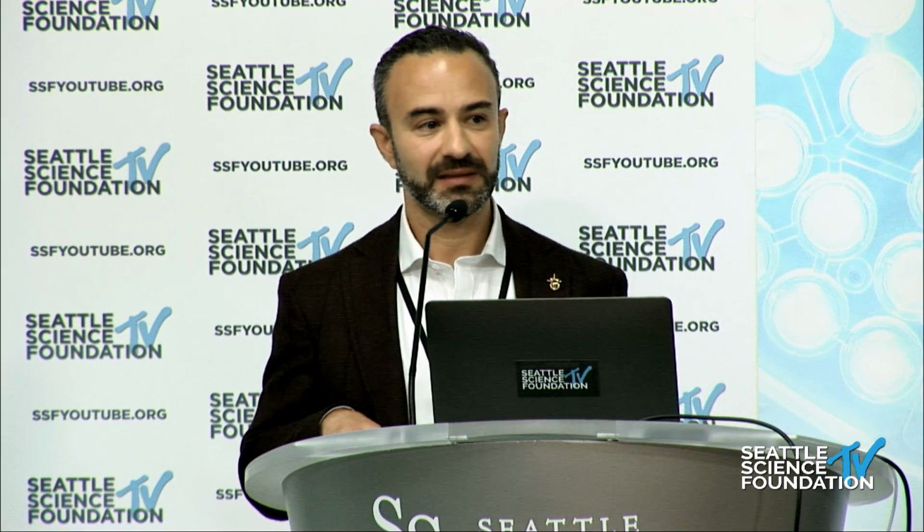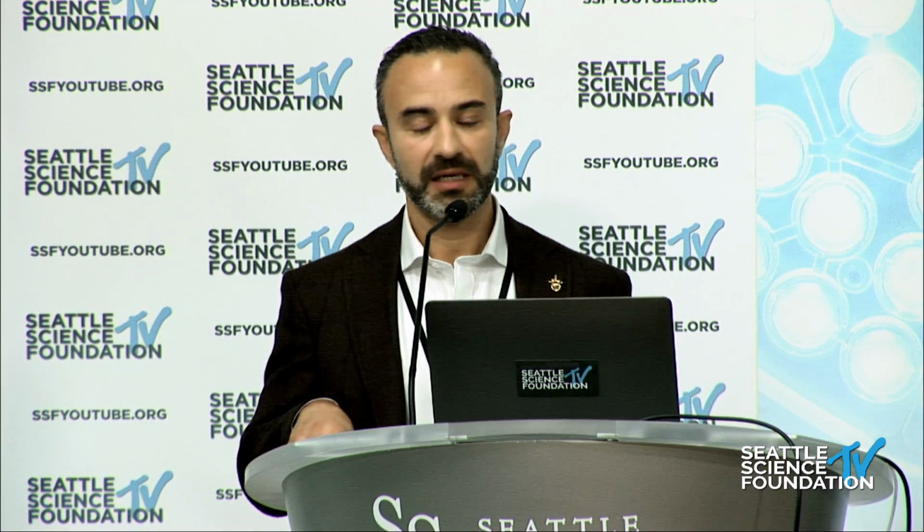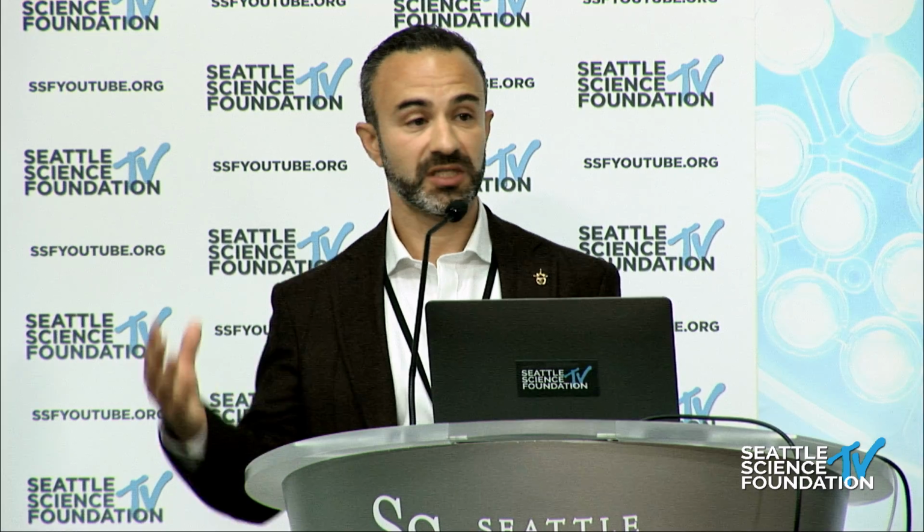But I have seen in my practice one time, and with my partner's practice several times as well, that the cages dislodge. These could be immediate, like you flip the patient and they're dislodged, and we've seen it in staged patients and also early before discharge. So a big concern. One time I've seen the screw actually just plow out rather than the cage pop over, but I've also seen it pop over the washer because it's very small, 2 to 3 millimeters.